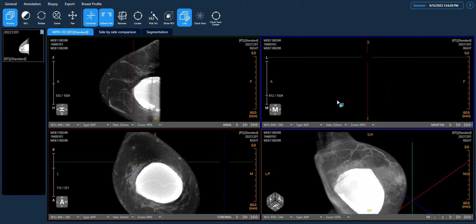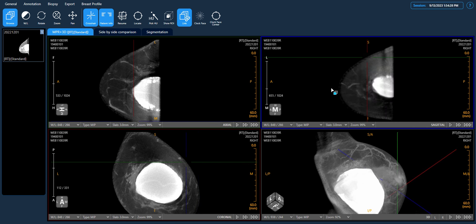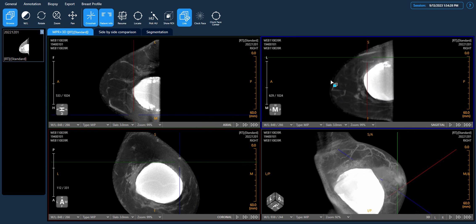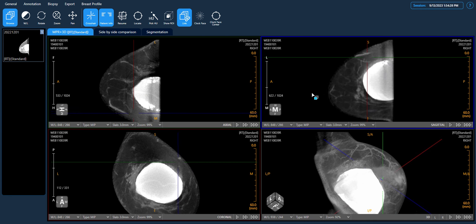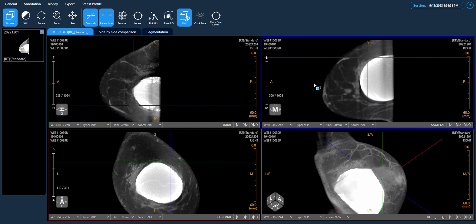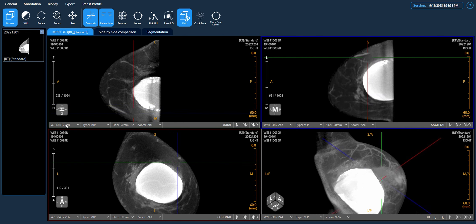The default window and level are set up for soft tissue review, so the implant usually appears very bright with such soft tissue settings. If we need to focus on the implant itself, we can choose other window and level settings to highlight implant details.